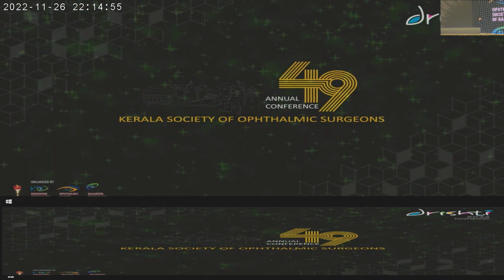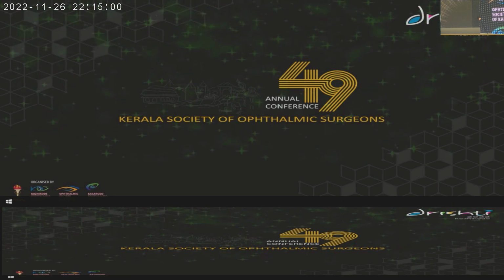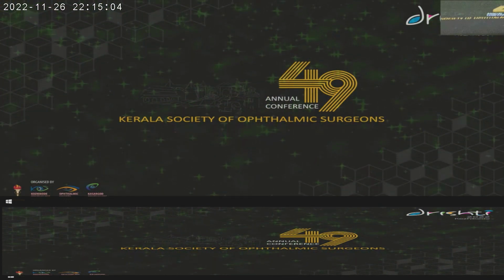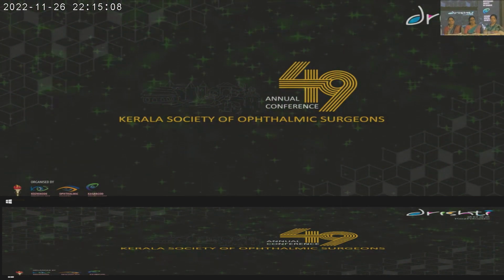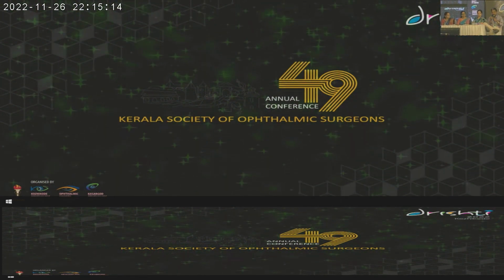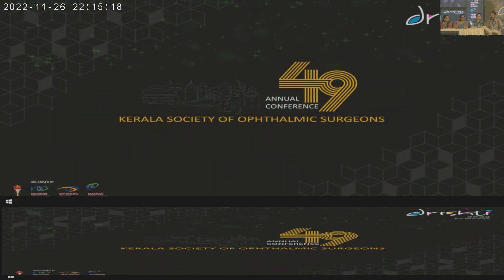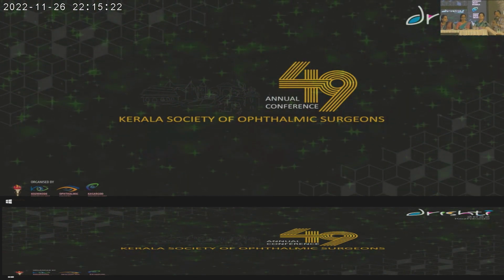Our lenses, IOLs, are still not perfect. We are still finding out newer higher order aberrations, so we cannot give them the vision they had with their own clear lens. Plus, when you're looking at an anterior chamber which is 0.5 millimeters, your phaco probe has to get in there and work. It's not for the run-of-the-mill surgeon. I take probably 2-3 times the time I take for a hard brown cataract for doing one of these early cataracts in angle closure.